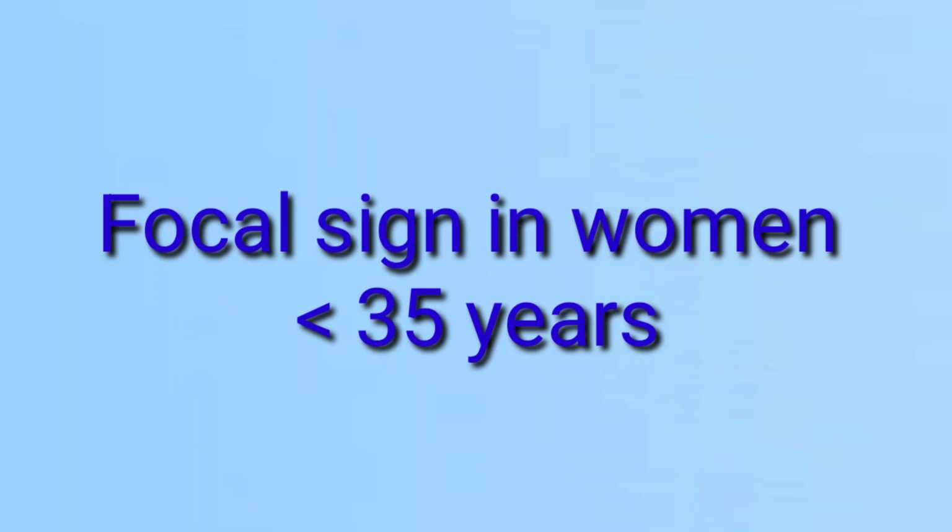So in that context one should have an ultrasound if the clinician recommends it for the focal sign, and there is some suspicion created by the radiologist within the mammogram or other radiological imaging, or maybe suspicion is created by the pathologist if a biopsy is taken and there is something fishy on the biopsy as well. In that case, ultrasound is a very important technique, and one should have an ultrasound when there are focal signs.